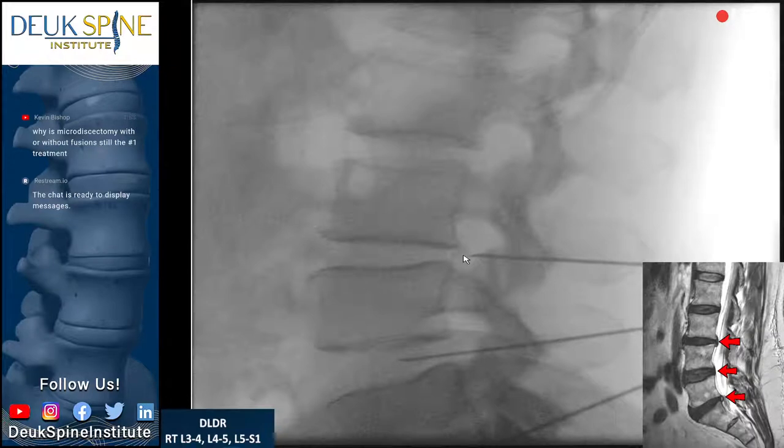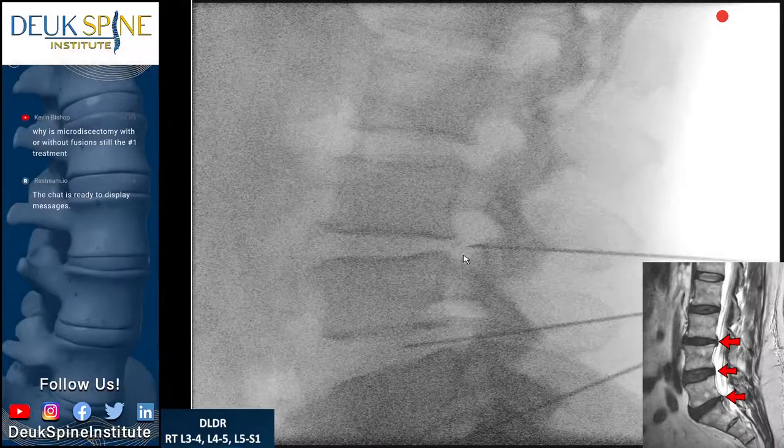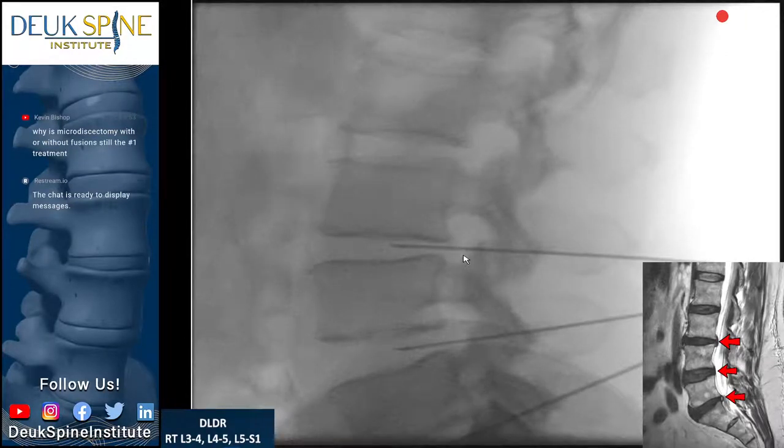So we're very close to being done with the positioning of the needles, which is the first step of the surgery. Next, we're going to do our discogram. We're going to test these discs to see if they truly are painful. That's perfect. We're in perfect position. It takes some practice to get used to putting these in, but yep, really good. Again, it went in very easily because the tear where the herniation's coming out is just so big. You can see on the MRI that there's a big tear back there. It's called the annular tear, and that's what makes herniations possible. The first step in all herniations is the annular tear.